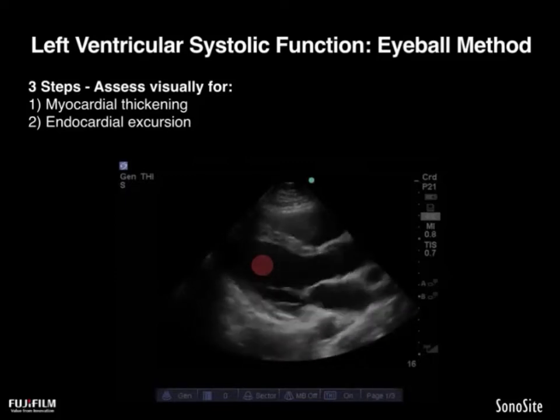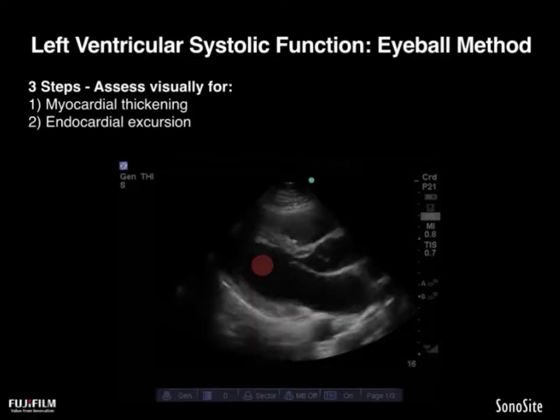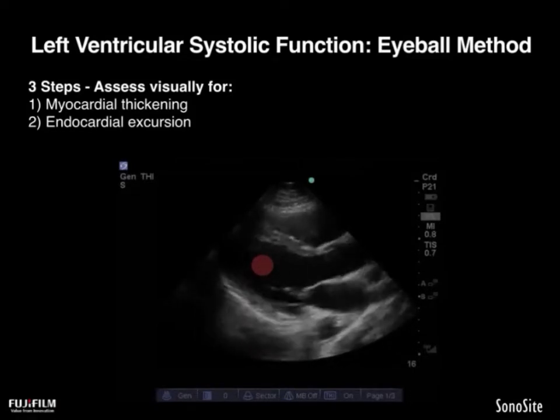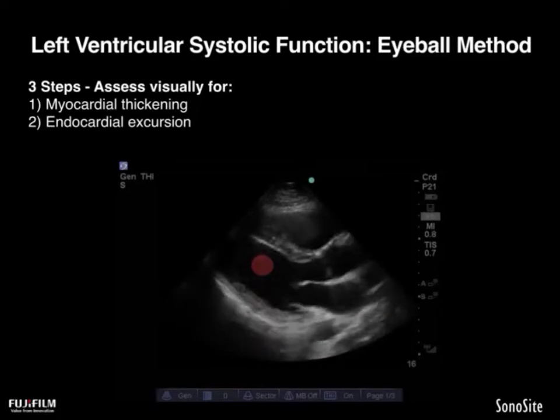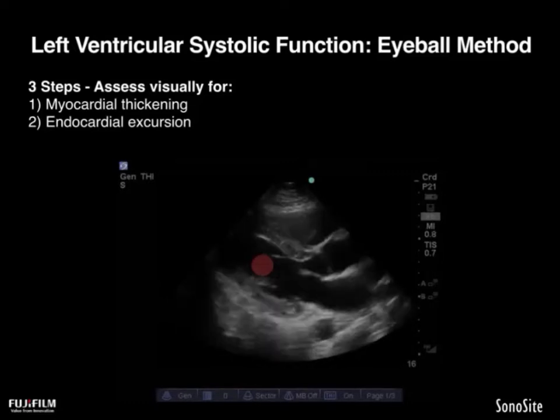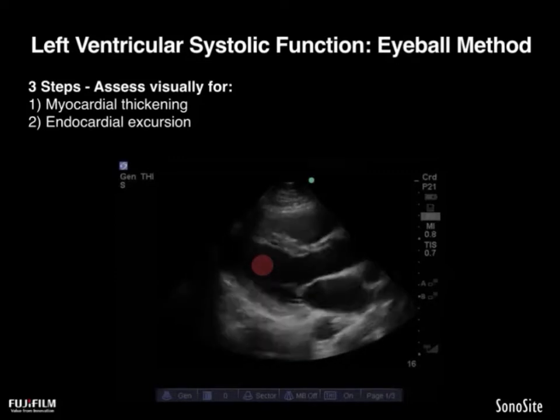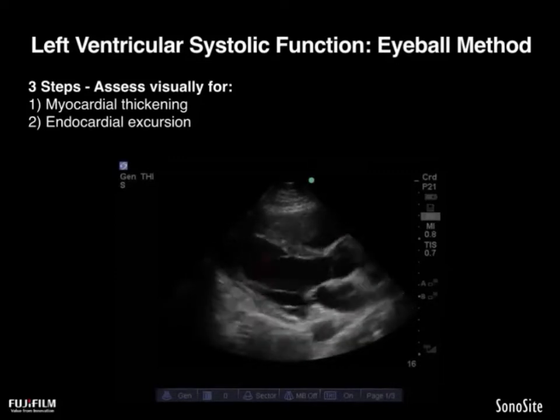This red dot here provides you with a visual goal to look at, but the beginner is encouraged to sometimes just place their finger on the screen or imagine a similar red dot in place. Here we can see that the 2 walls pictured in the parasternal long are indeed moving towards this centric point.